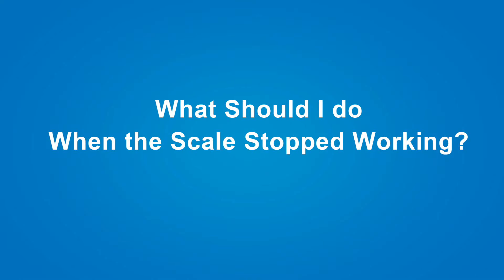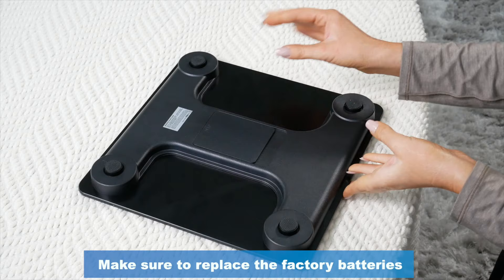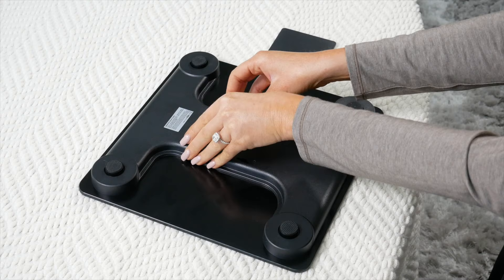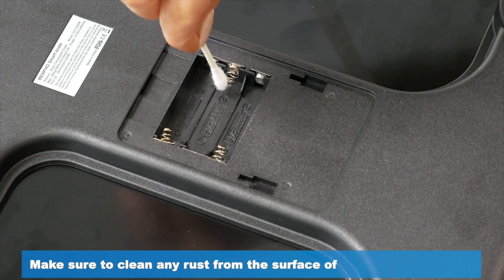What to do if my scale stops working. Make sure to replace the factory batteries. Use only the batteries listed on the approved battery list as displayed. Make sure to clean any rust from the surface of the battery contacts to make sure that you have a solid connection.